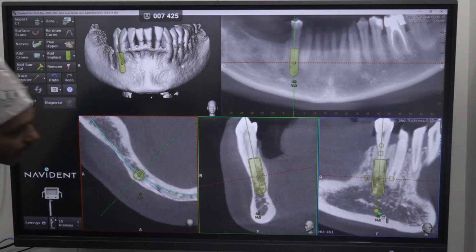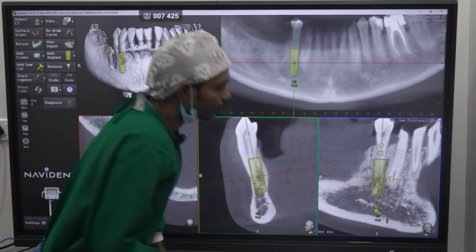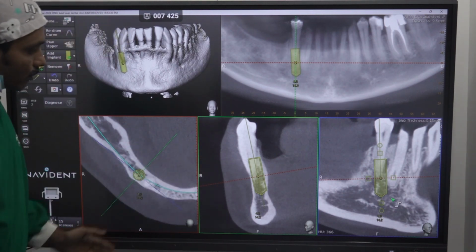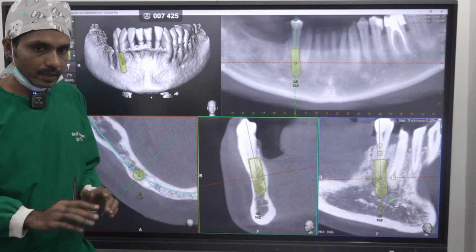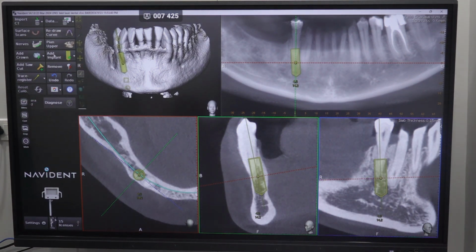We can clearly observe the loop coming here, right? Yes. This is the mental foramen coming loop. So slightly mesial tilt will be fine. Okay, 4 into 14 or 3.4 into 14 something. But still, as we already discussed, long face syndrome, the buccolingual width will be very thin. Now we'll plan for 4-2.